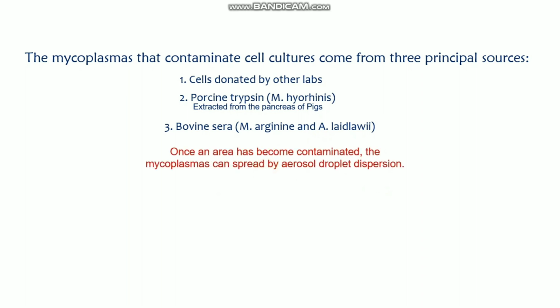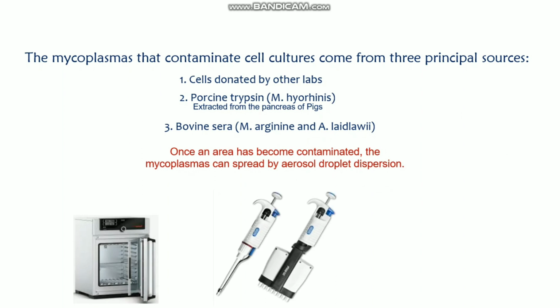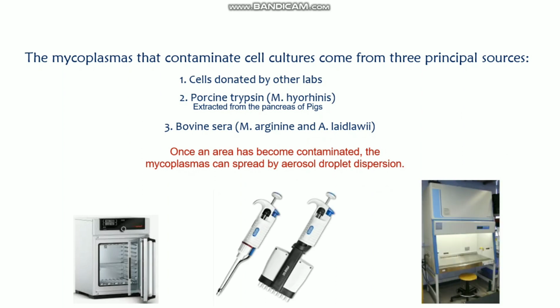Once an area has become contaminated, the mycoplasma can spread by aerosol droplet dispersion, and then it can contaminate the incubator, the pipettes, and even the cell culture hood. So it is going to influence your cell culture completely.